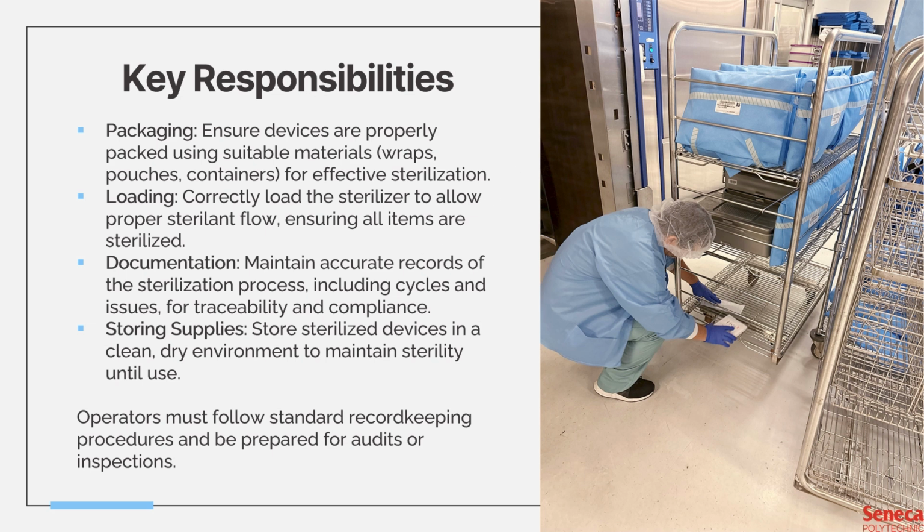What happens there is, they will gather condensation again and start dripping down on sterilized equipment and devices. So you really have to wait the proper time for them to completely cool down. And it's not just for the sake of storing them properly. It's also for the sake of the operator's safety.